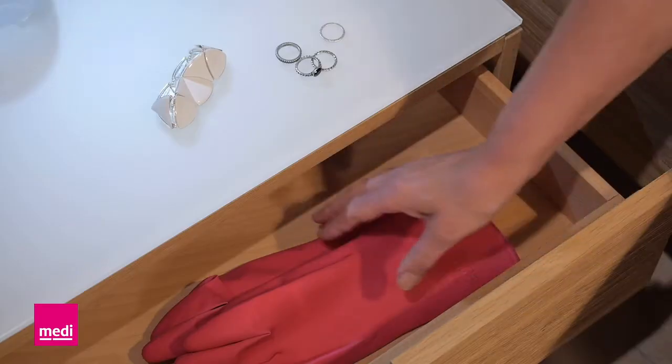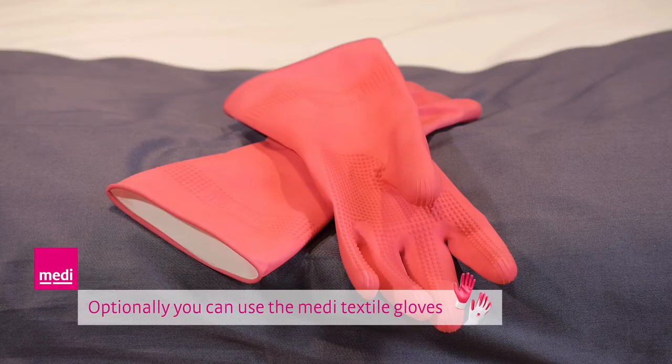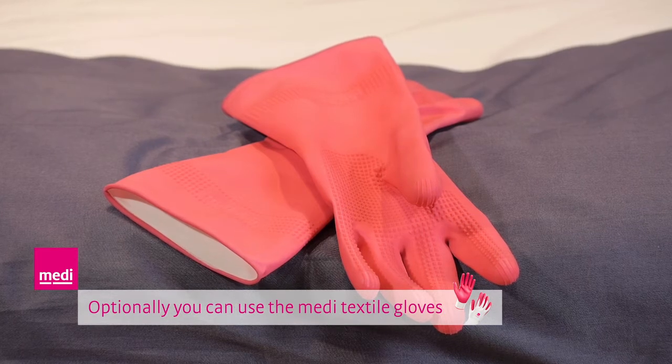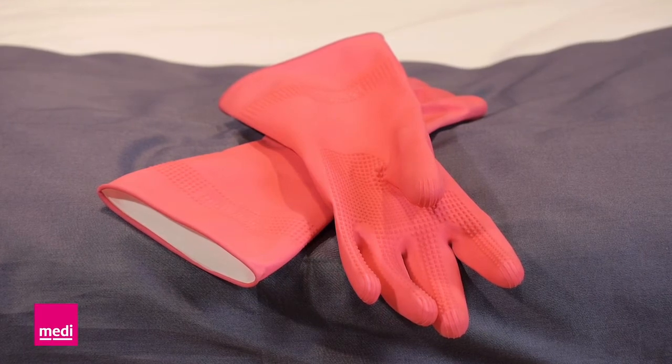Please have your rubber gloves ready as well. You will use these later to smooth out the material over your arm, or you can put one on immediately and wear it while you are putting the arm sleeve on. The rubber gloves adhere particularly well to the arm sleeve and aid application.